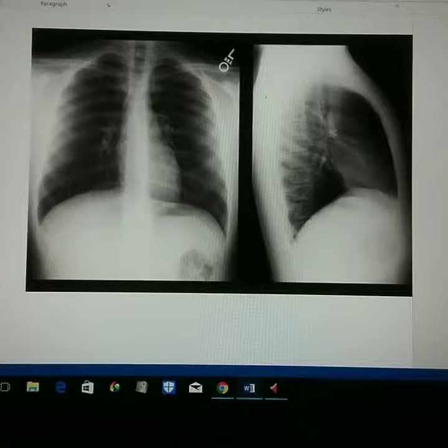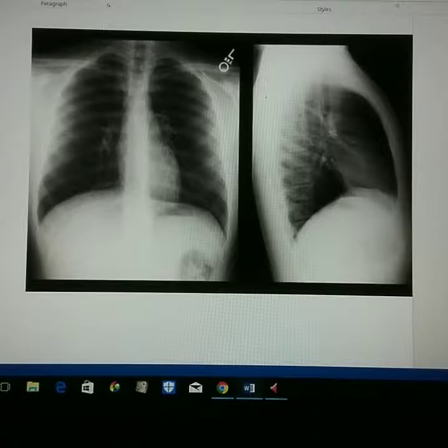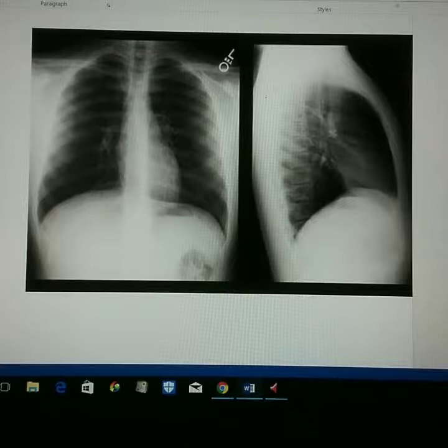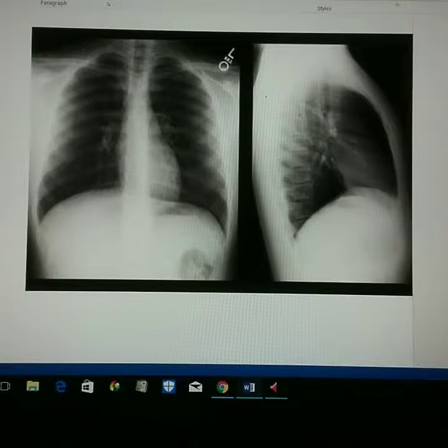Now that we've taken our images, we want to evaluate them and make sure that we have all the proper criteria for a good PA chest and lateral chest. Starting with the PA chest, we want to make sure that we have good collimation, which would be evident by the entire lung field from the apices down to the costophrenic angles being in view.